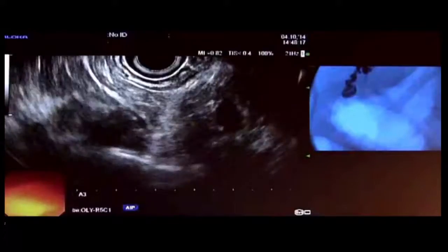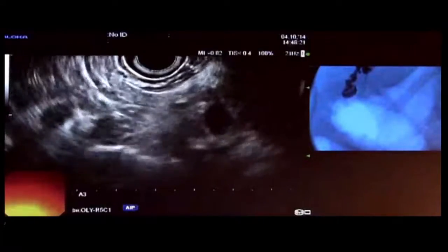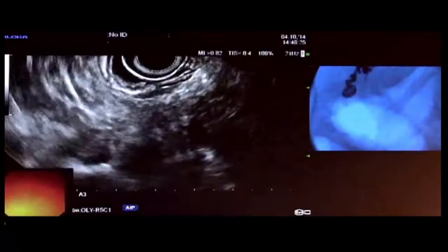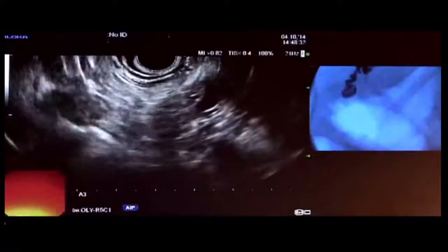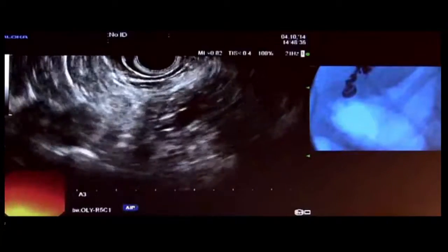All right, now there's another needle called the access needle from Cook. With that needle, you have to puncture with your stylet in, because the stylet is what makes the needle sharp. So the problem there, the limitation of the access needle, is you have to be sure that you aspirate some fluid before you inject your contrast, because otherwise you're going to get air bubbles inside of the duct.